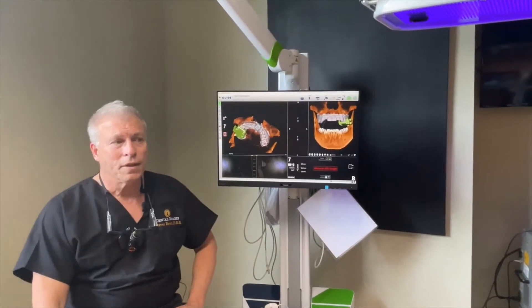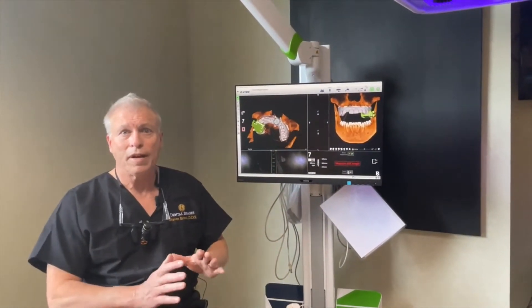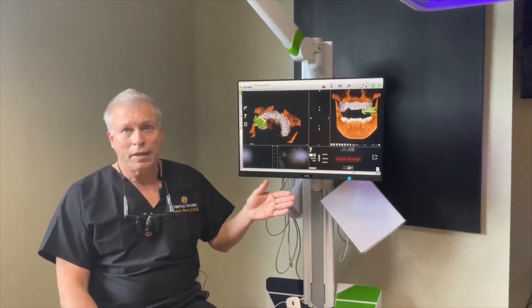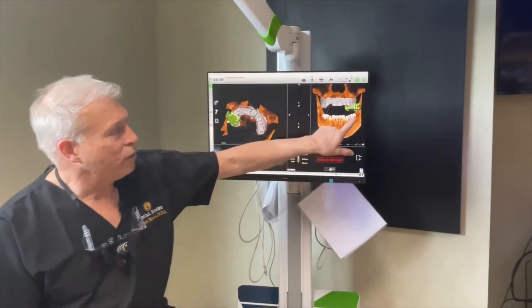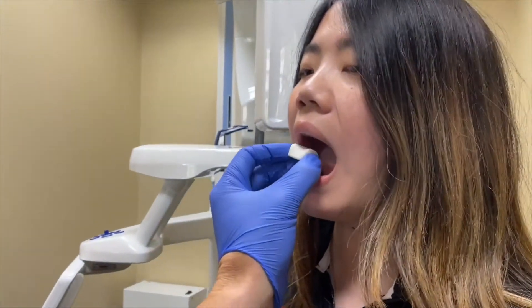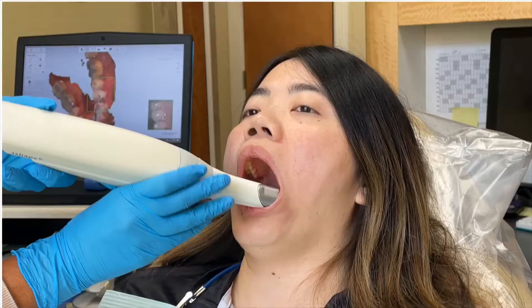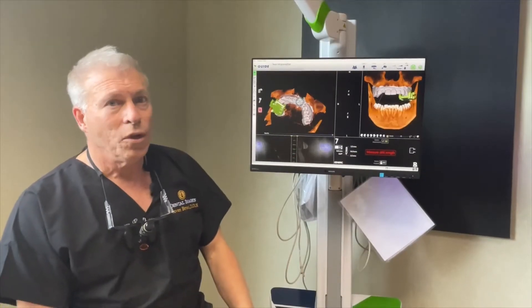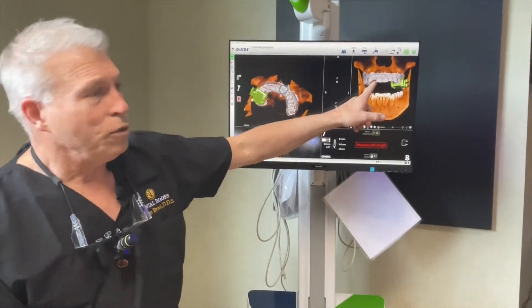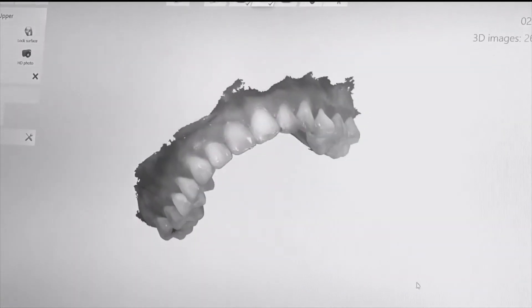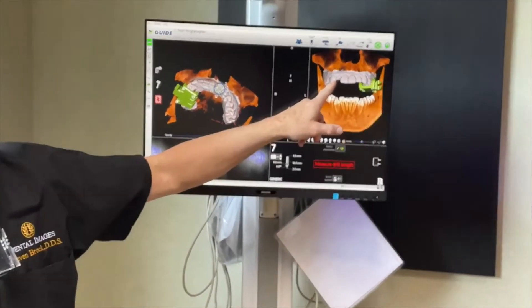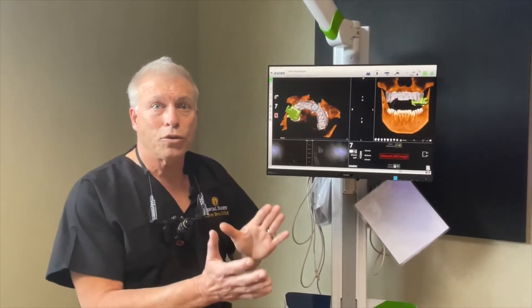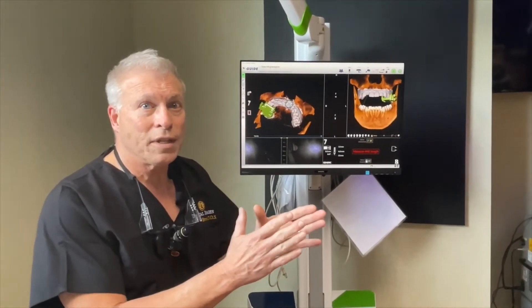The X-Guide procedure is relatively straightforward. When the patient comes in, we identify the need and available bone for a dental implant. We then place a fiduciary marker in the mouth and perform a CBCT scan with it in place, creating a reference point to the patient's anatomy that we can reference throughout planning and the surgical procedure. Once planning is done, the tooth can be digitally designed and placed back so you see exactly the prosthetic endpoint we want to support — we can see available bone and tooth contour anatomy so that the implant and prosthetics are joined together in the plan.